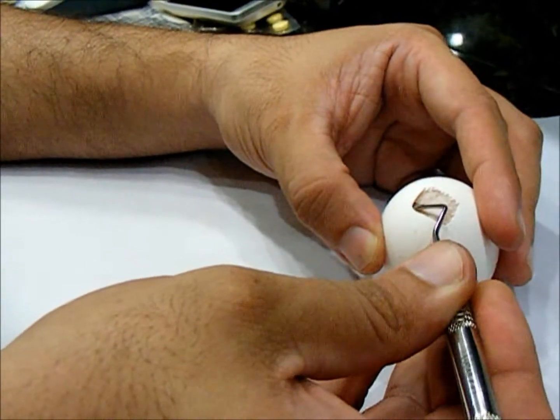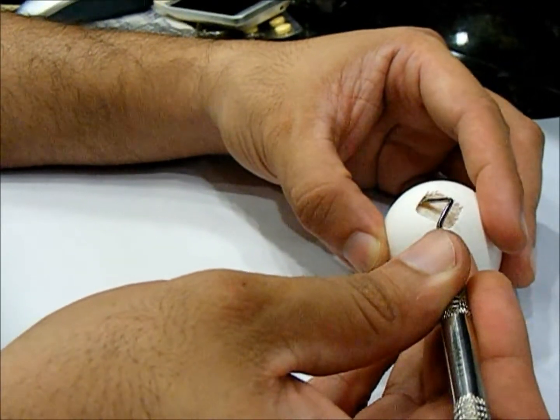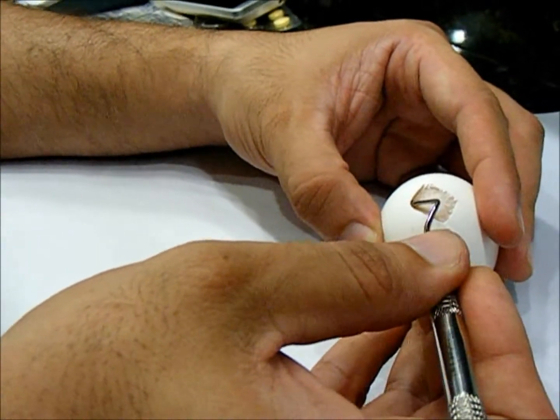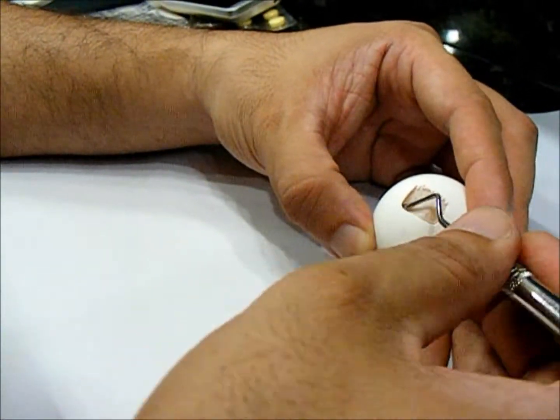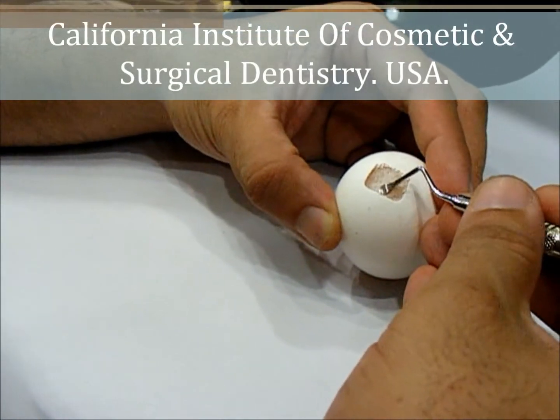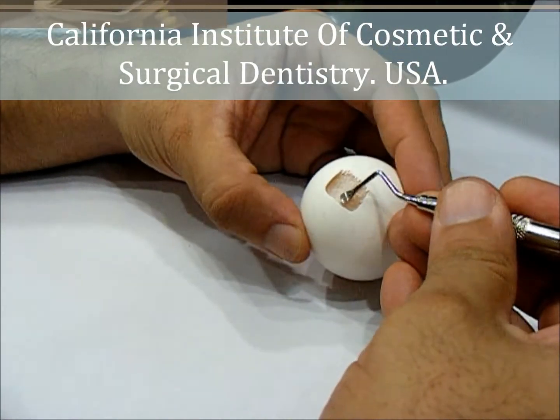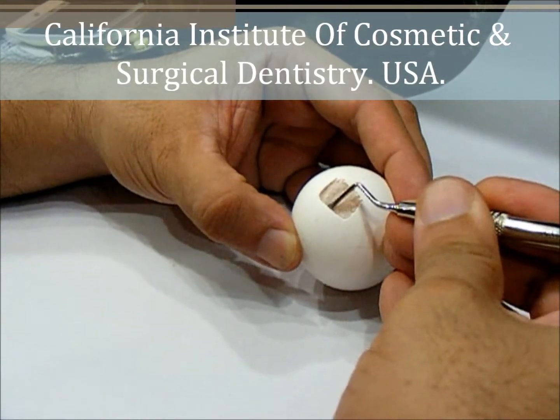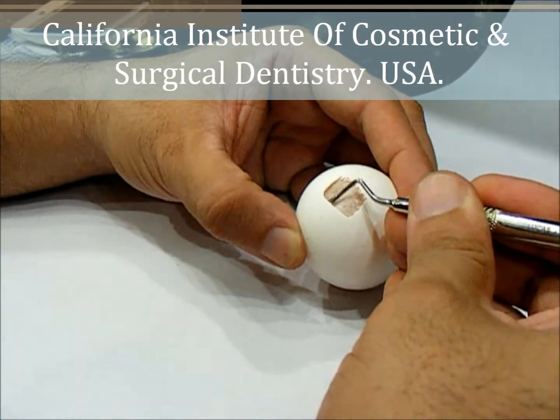Slow but steady, I am able to advance my instrument to about 3 to 4 mm in depth. One thing has to be understood: here in the case of an egg, the internal anatomy is very nice and smooth — you are not going to get that in the maxillary sinus.